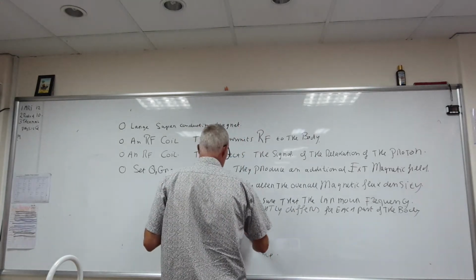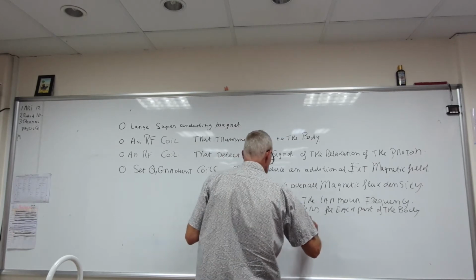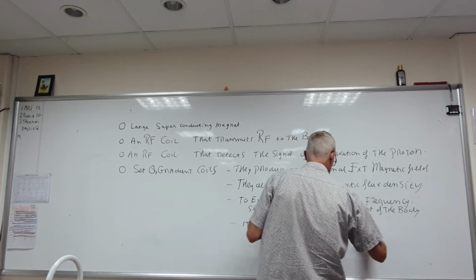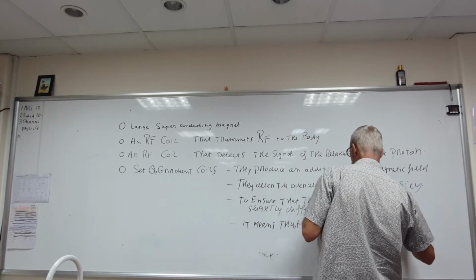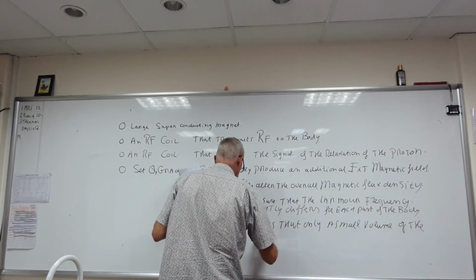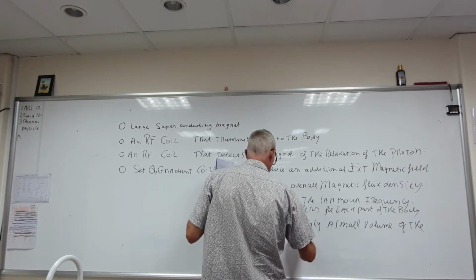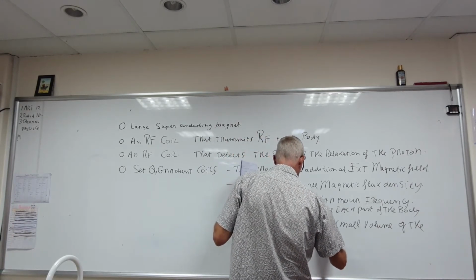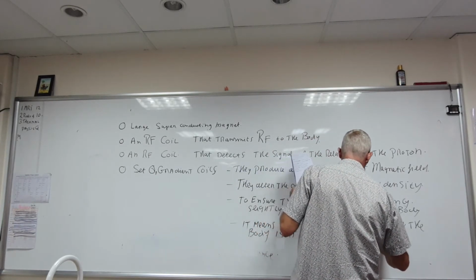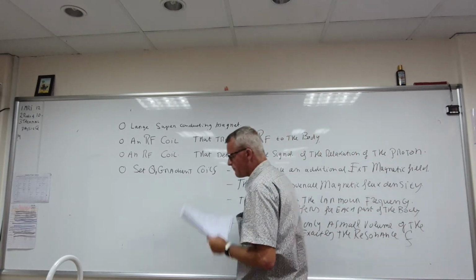So, that means that only a small volume of the body is at exactly the resonance frequency, okay?